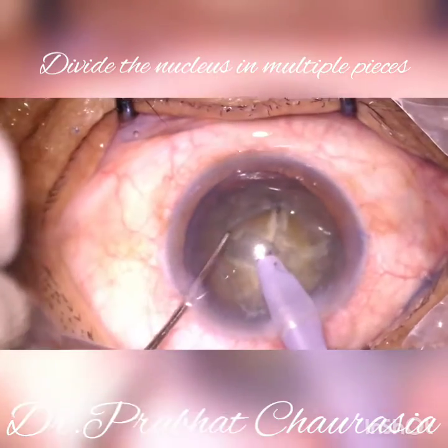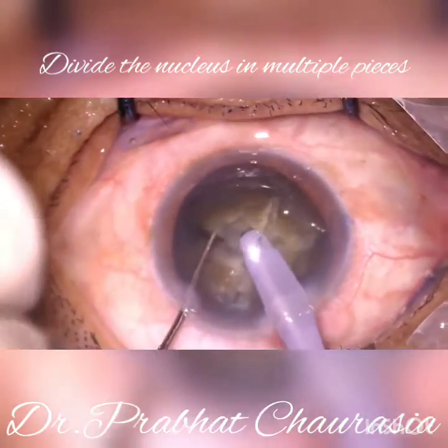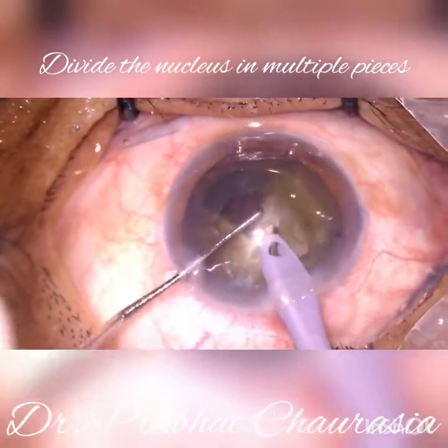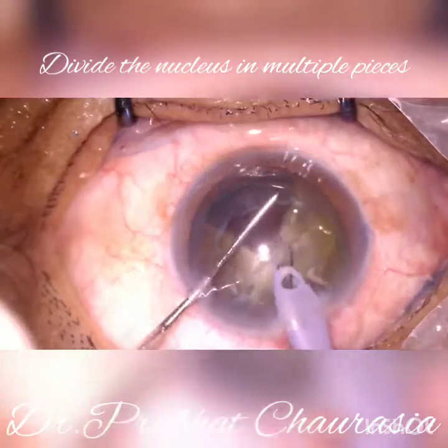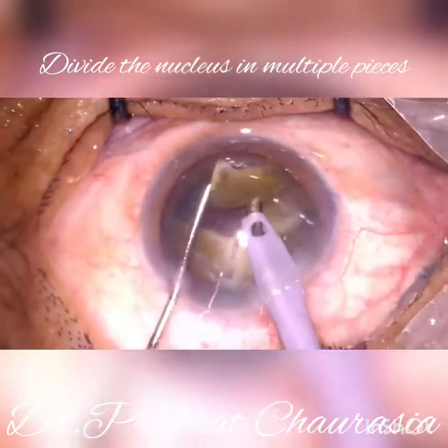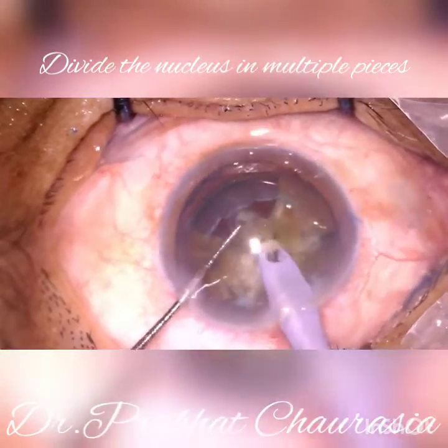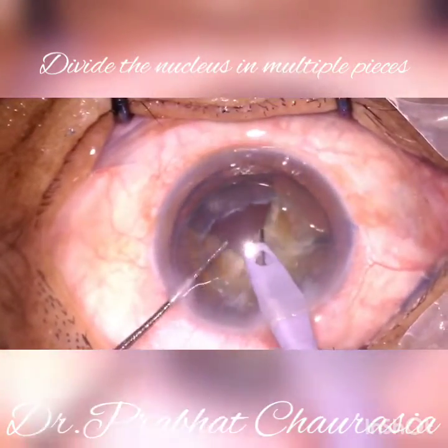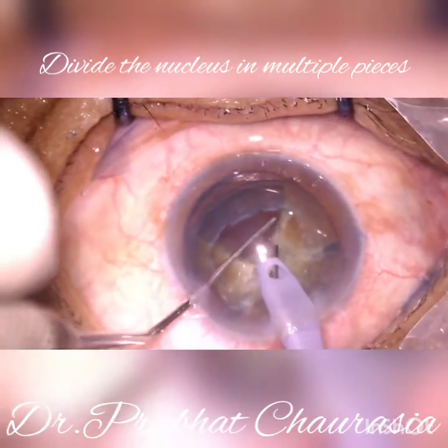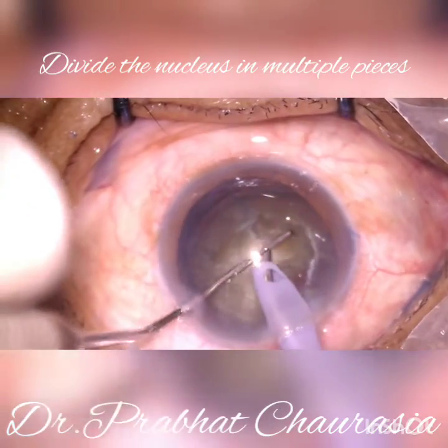After making multiple chops, lift any one nuclear piece and then emulsify it in US3 mode. Emulsify every quadrant one by one.